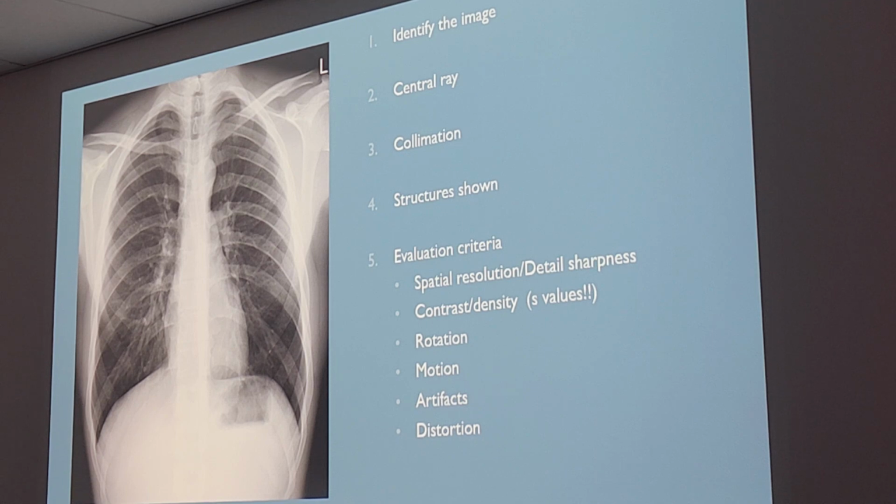So what kind of detail should we see on a chest x-ray? Black for the air and white for the blood. That's contrast. I'm talking about the details you should see. The hilar region, where you see what? The pulmonary vascular markings, which is the bronchial trees. What else?